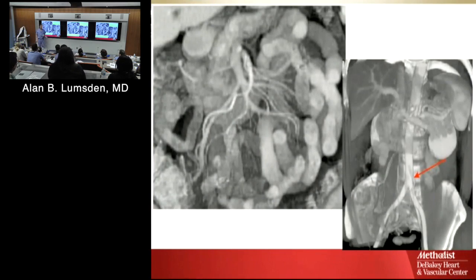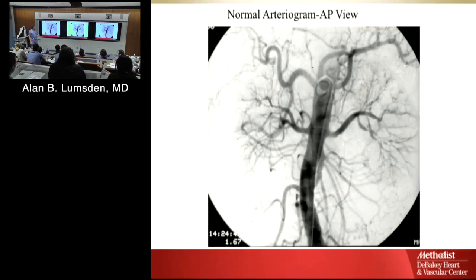So, patient comes along with belly pain. You think they've got mesenteric ischemia. What vessels are you going to look at? Celiac, SMA, IMA, and hypogastrics. Okay, those are the four things that you're going to be interested in. You really kind of want to define them. So, again, what kind of catheter is this? Pigtail catheter. Injection rate? 20. Very good. Okay, blast across the entire thing, and so it's up high. This is positioned at the hiatus, so it's filling all the vessels that are down in there.